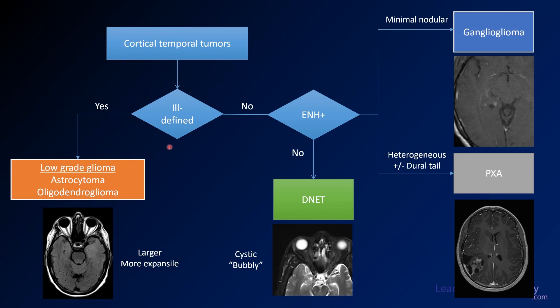Going through this flowchart: if it's ill-defined, you're thinking about low-grade gliomas — astrocytomas and oligodendrogliomas. They tend to be larger and more expansile. Here you see an example where the left temporal lobe is expanded and ill-defined. If it's well-defined and you don't have enhancement, and it's a little bit bubbly looking like in this case, you're thinking about a DNET.